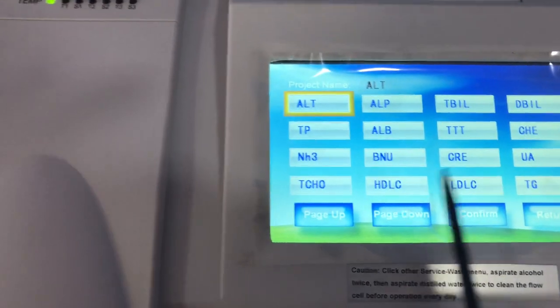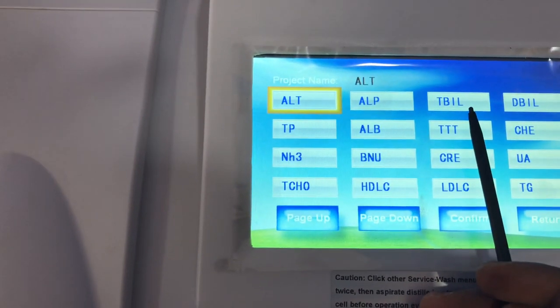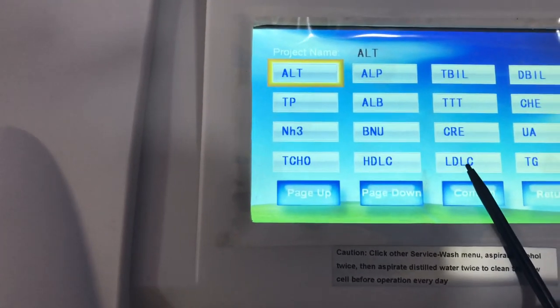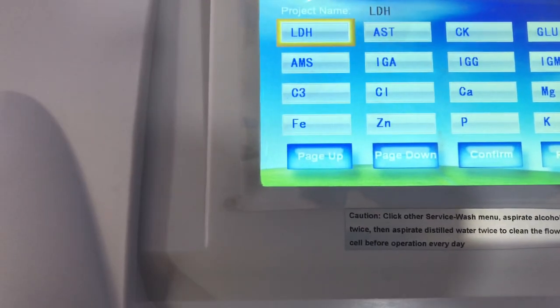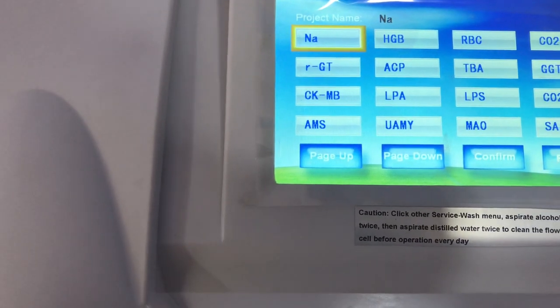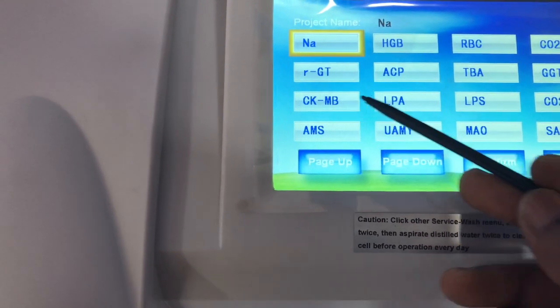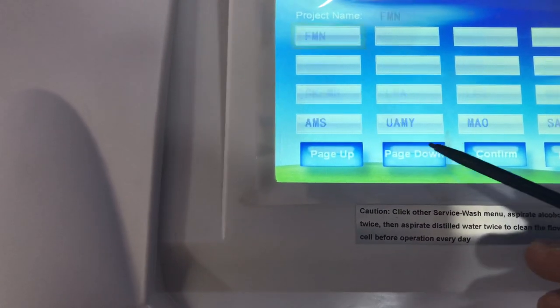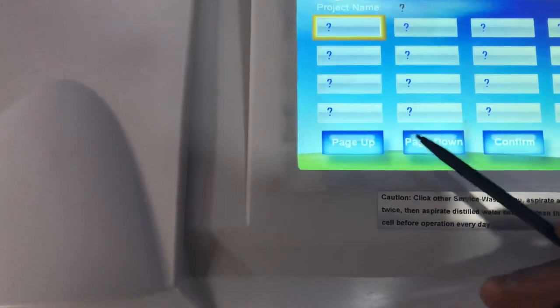There are a number of parameters you can select for testing: ALT, ALP, total bilirubin, direct bilirubin, LDL cholesterol, TG. You can scroll down for more tests — calcium, magnesium, CK-MB, gamma GT — and you can continue scrolling until the list is exhausted.